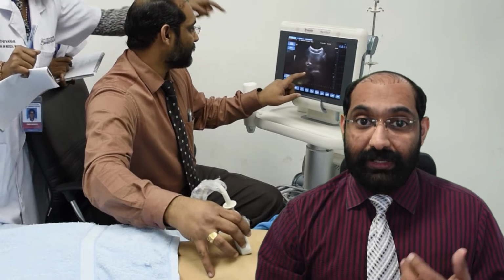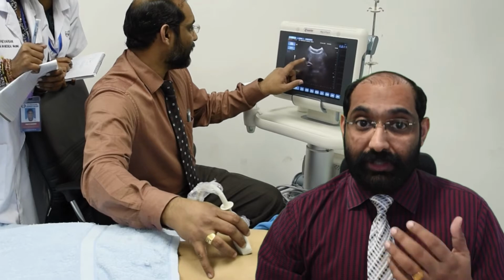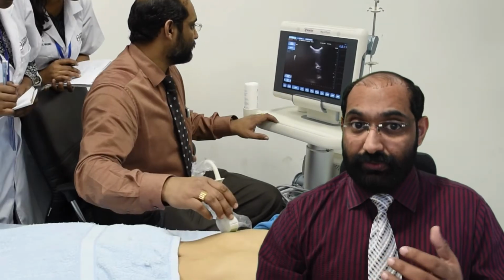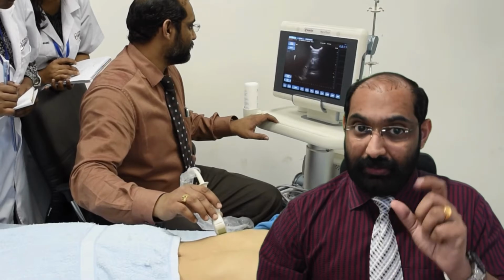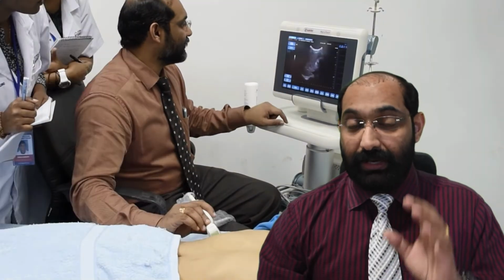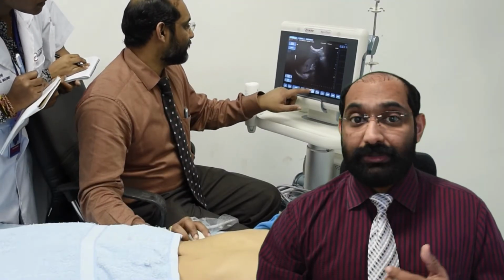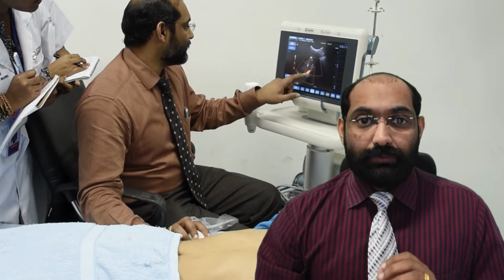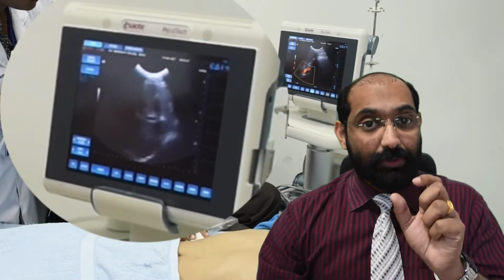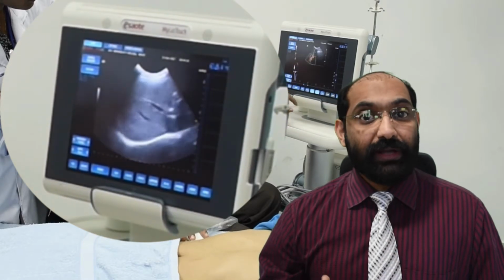As the wave interacts with the tissues of varying elastic properties and densities, they generate echoes, which direct back to the transducer. Once the sound waves reach the transducer, those piezoelectric crystals convert these ultrasound waves, or the high-frequency pressure waves, to electric signals. It occurs more than 1,000 times in a second. Those electrical signals are translated to form bright spots on the monitor, which correspond to the anatomical organs and the strength of the reflecting echoes.